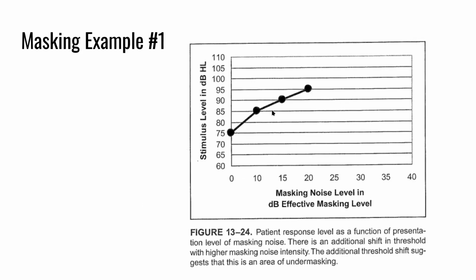And we received a response at 90 dB. Here we see another 5 dB shift in threshold, so it's at 95, but that's with 20 dB of masking.